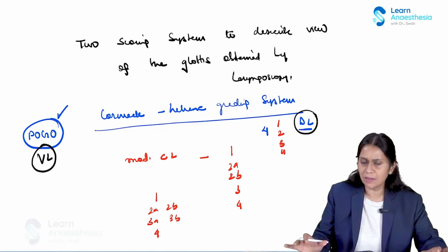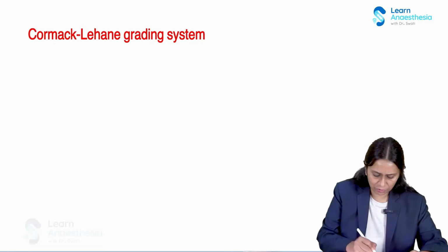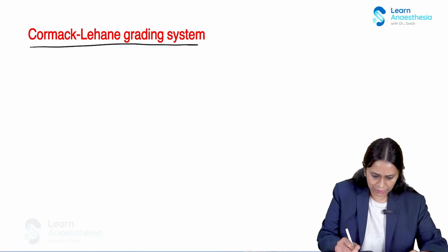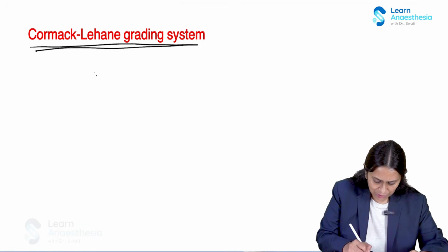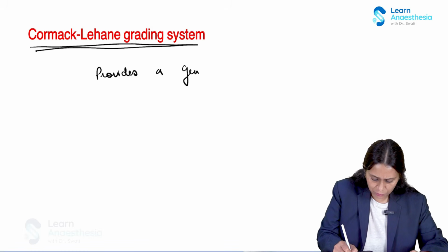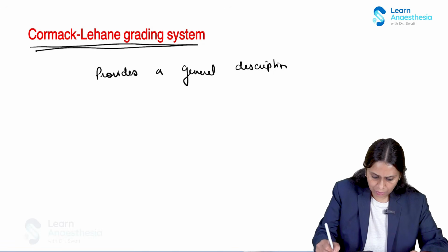So let's first discuss what the Cormack-Lehane grading system is. As I said, this provides a general description using four categories.